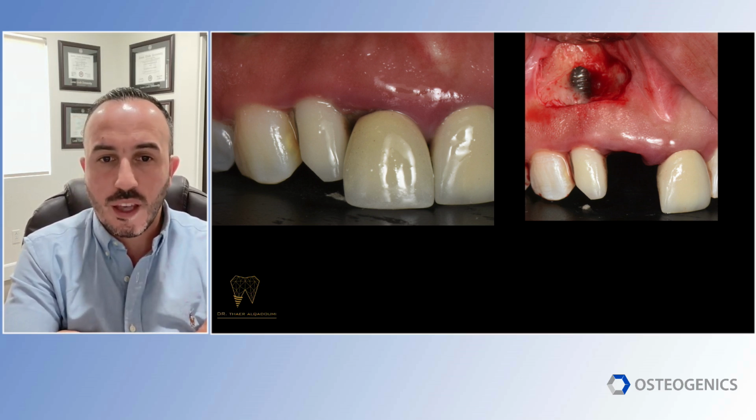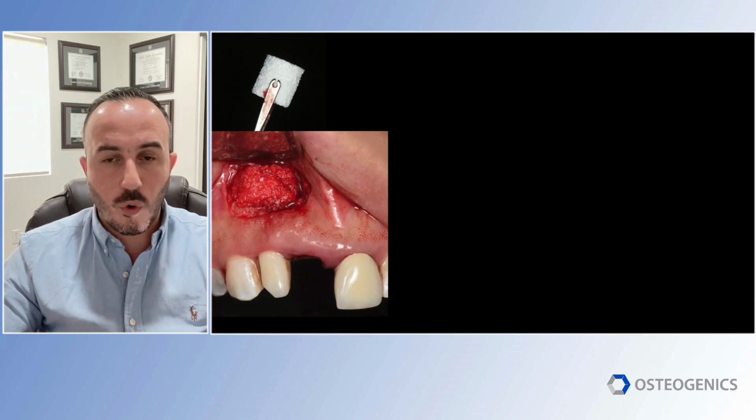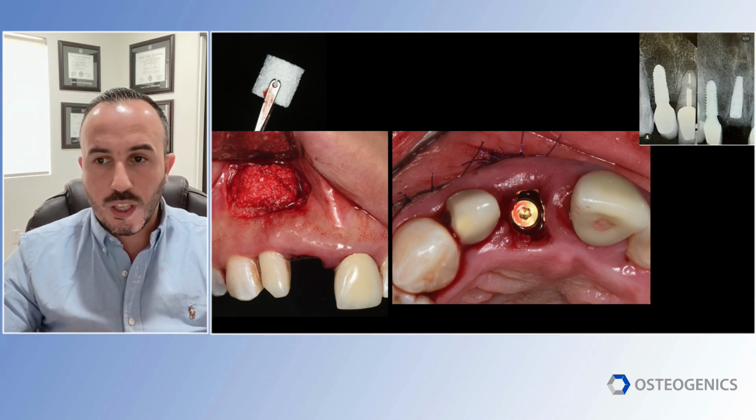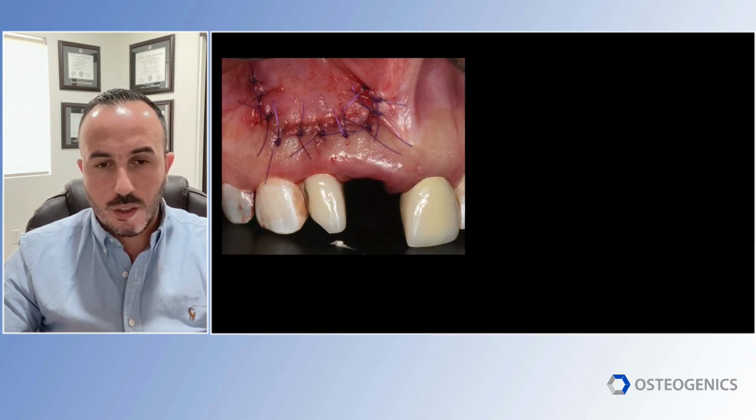So most probably that older implant was placed and the apical part was out of the bone when that happened. So it's not a disease. So what we do, we just clean, remove all the soft tissue tags. Here I used Z-Core Z-Form, and we place it over, and a collagen membrane laid over it. We place the implant and we suture back using Glycolon.